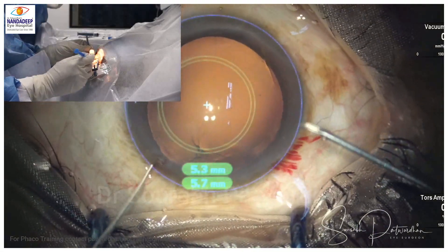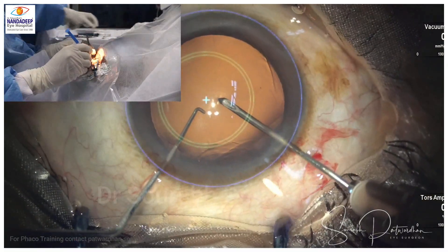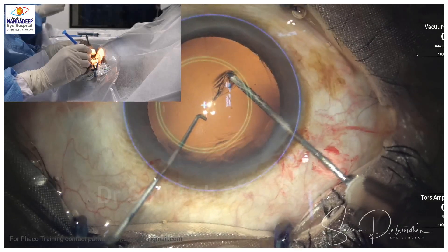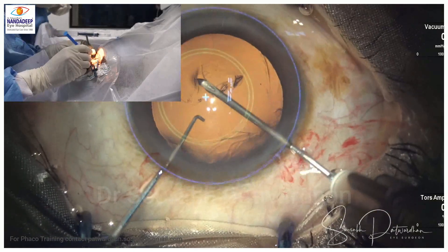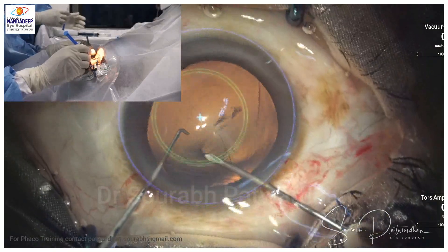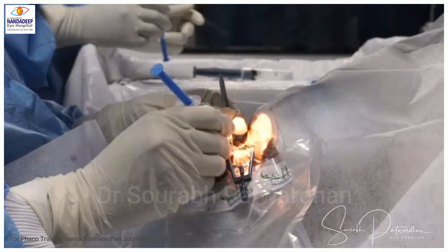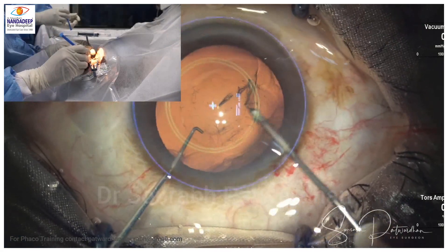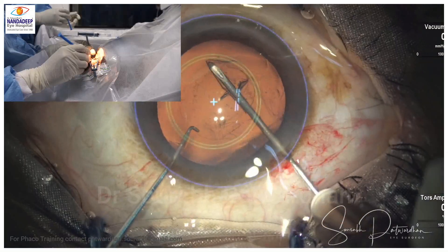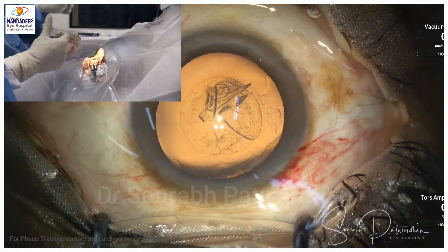Here I am doing capsulorhexis — just watch my hand. It's going at an angle above the plane of the eye, and this is to maintain the anterior chamber. I am always trying to tent up the incision so that there is no viscoelastic leak. During capsulorhexis this must always be maintained, because if we depress the posterior lip of the incision, the anterior chamber will leak OVD and collapse.